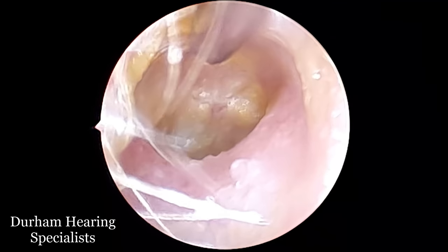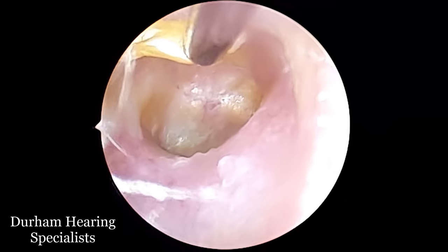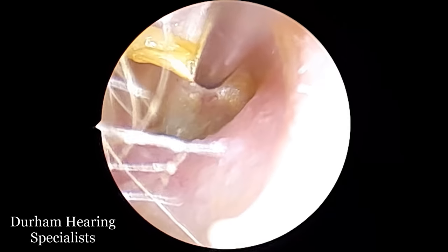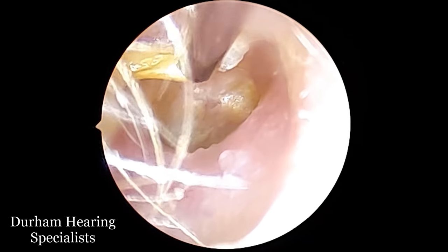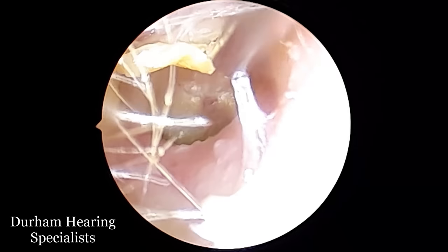So I told the patient to go away and apply some sodium bicarb drops in the hope that that skin would basically unstick — sort of unadhere. And now what you're going to see in this video is the removal of that dead skin to reveal the true eardrum back there.